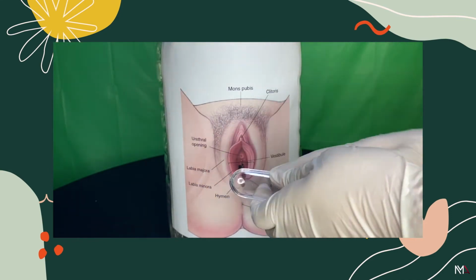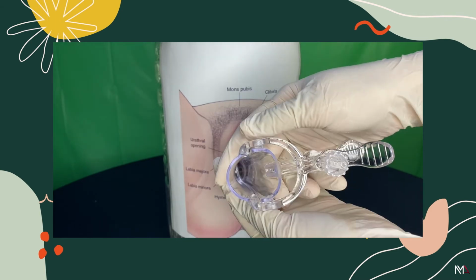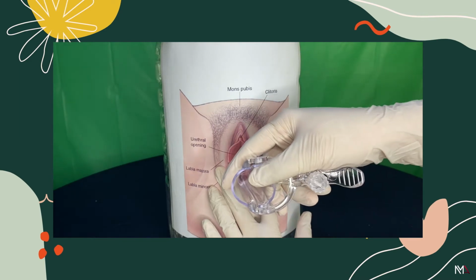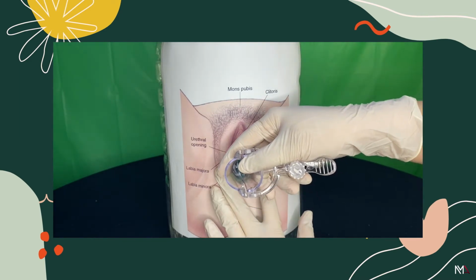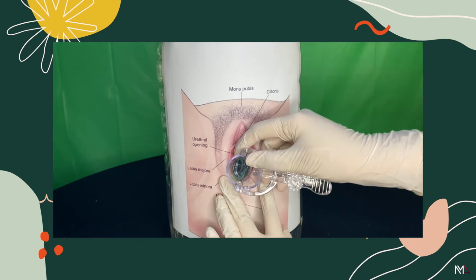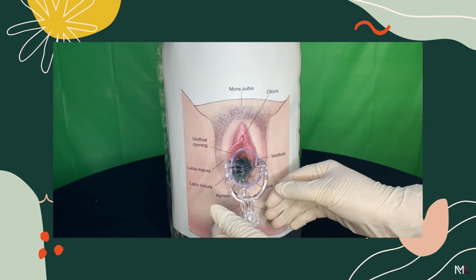Insert the speculum by placing the transverse diameter of the blades in the anterior-posterior position and guiding the blades through the introitus in a downward motion with the tips pointing toward the rectum. Once the blades are inserted, the speculum should be turned so that the transverse axis of the blades is in the transverse axis of the vagina.